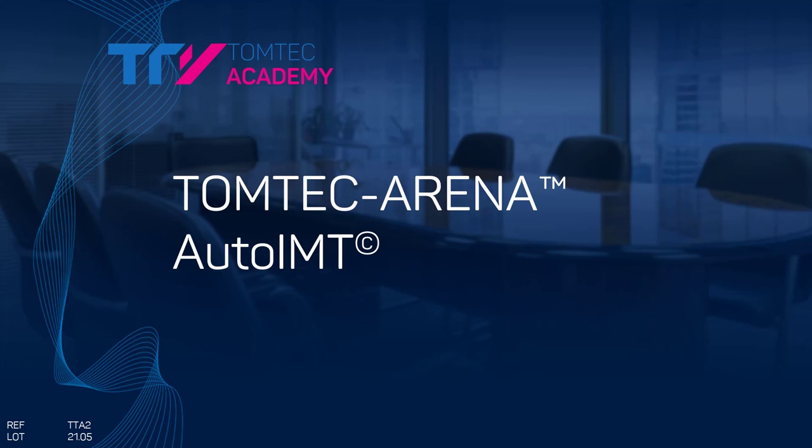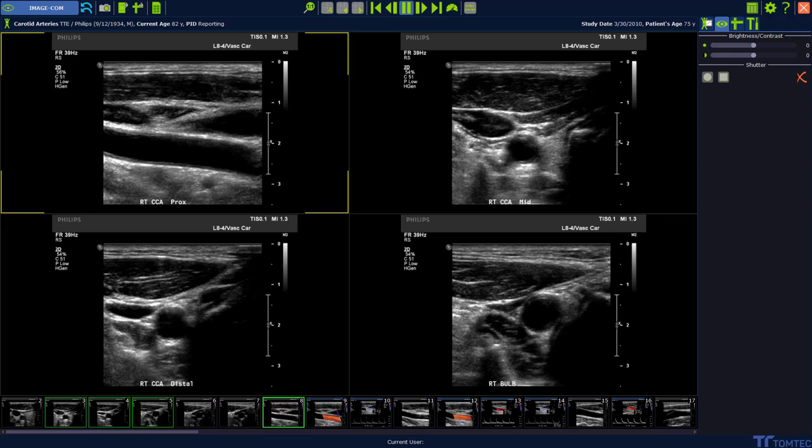Today I want to show you how to use AutoIMT. Start from Ingecom and select a vascular image.